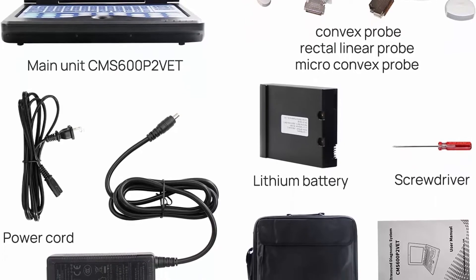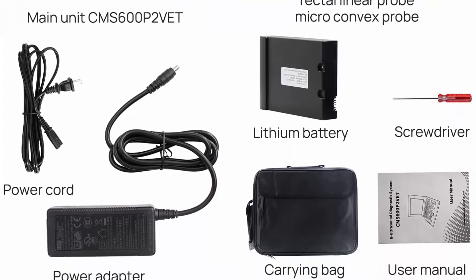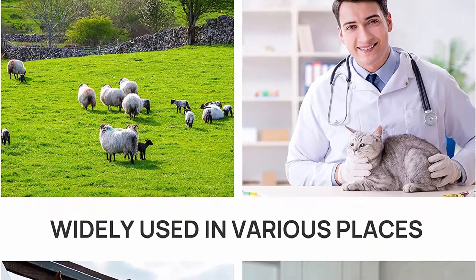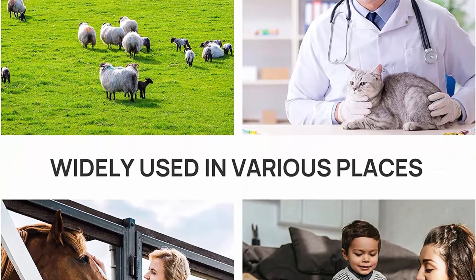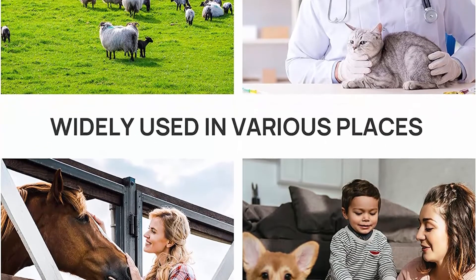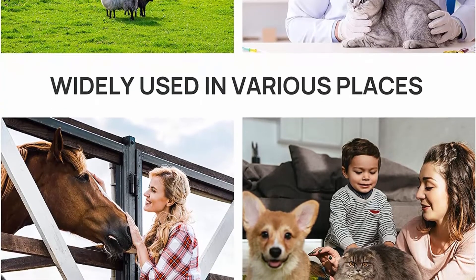The Contec CMS600P2VET is a veterinary ultrasound scanner for animal use. It features simple and easy image management. It has a 10.1-inch TFT LCD screen with display modes B, 2B, 4B, BM, and M. Its portable design is small and lightweight, suitable for mobile use, and includes one lithium battery.